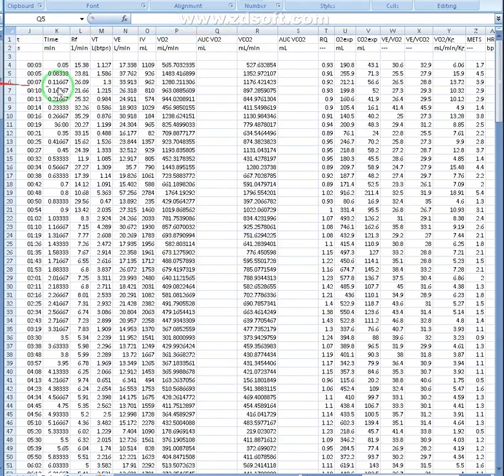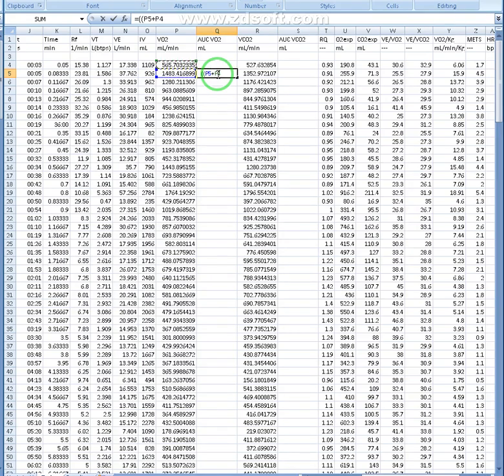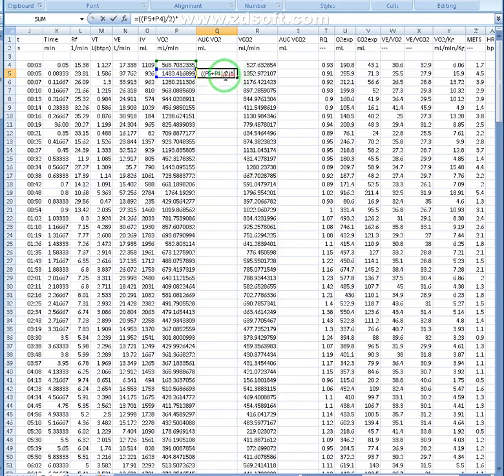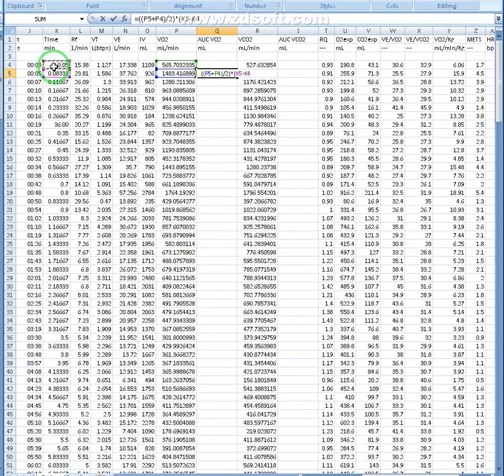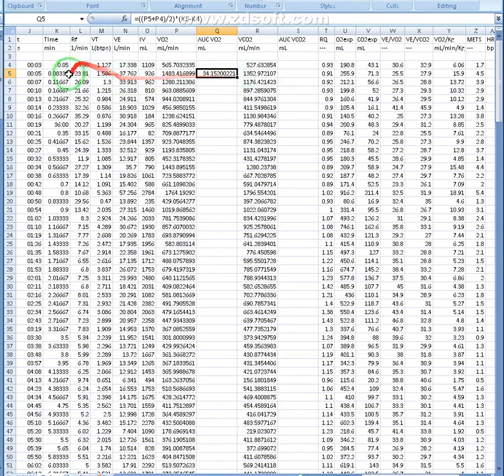Now we come to the formula that we're going to be using. To do area under the curve, it's going to be the trapezoidal method. So we'll do equals, two parenthesis, column immediately next to it, followed by the column above it in the same row, divide it by 2. It's just drawing a line between those two, finding the midway point between those two. And then multiply that by the change in time. This minus that. So the time at this point minus time of that point. So we should have a pretty small number here, 34 milliliters between that breath, between that time.